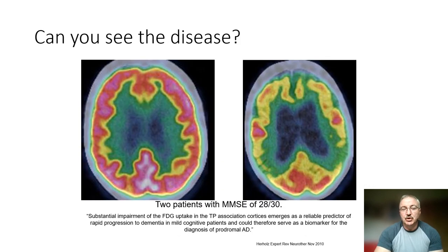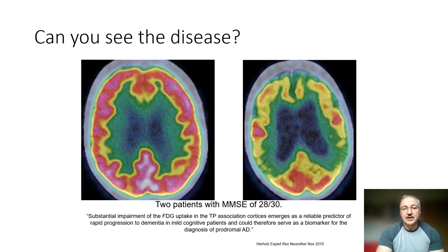Here we have two patients displayed on the rainbow scale, both with MMSEs of 28 out of 30. I want to introduce the idea that dementia is brain failure — and we can see which patient has brain failure. Using the rainbow scale for reporting can be difficult, so we set the intensity as discussed in previous lectures and then do not adjust it again. This helps maintain consistency.